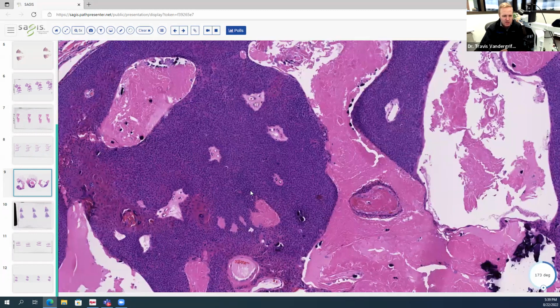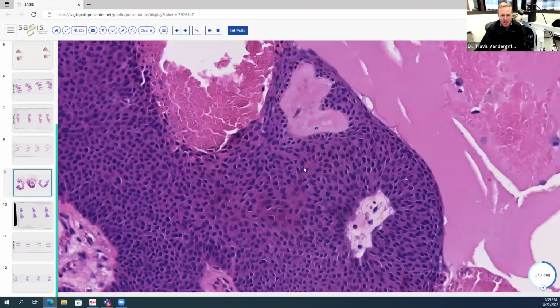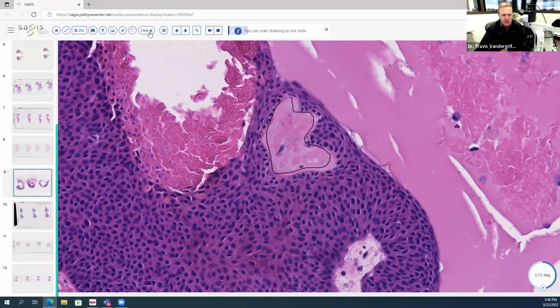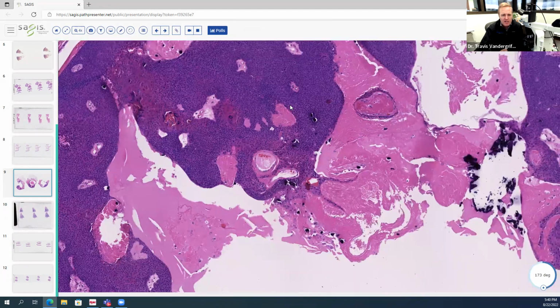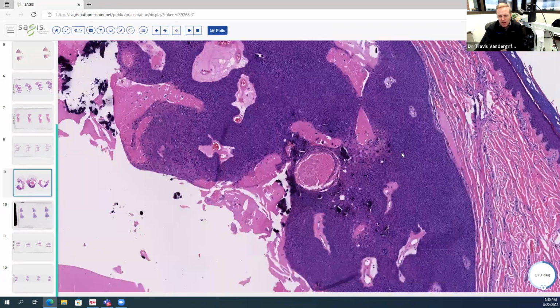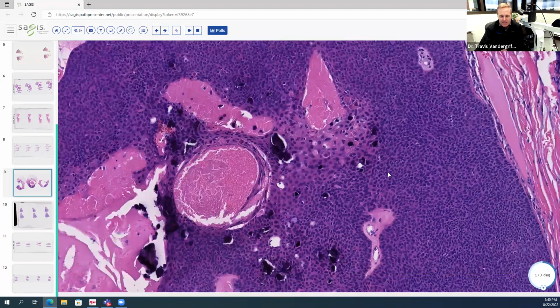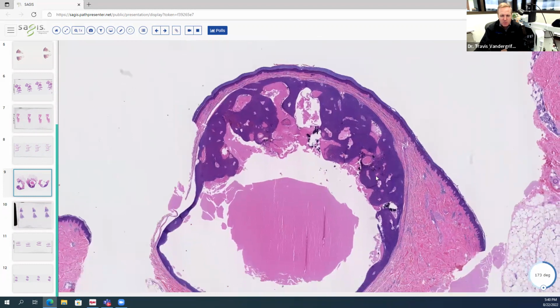And then as I look around here in the stroma of this tumor, I notice that there's a lot of hyalinized collagen. Hyalinized collagen is eosinophilic and very smooth. So these little bands of collagen have become hyalinized in the stroma. That type of stroma with hyalinized bands of collagen is a hidradenoma stroma, the stroma that's associated with hidradenomas. So hidradenomas are sweat gland tumors derived from eccrine sweat glands. And there's some significant overlap with the family of eccrine tumors called poroma.